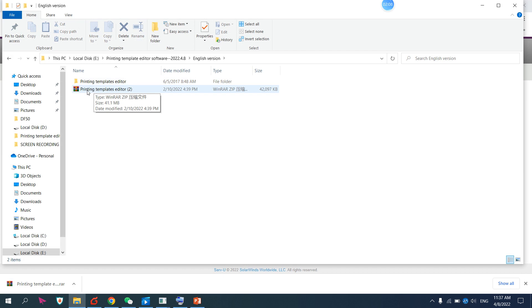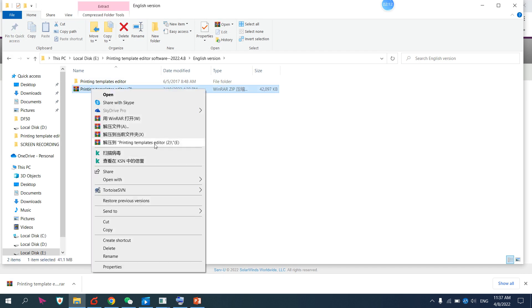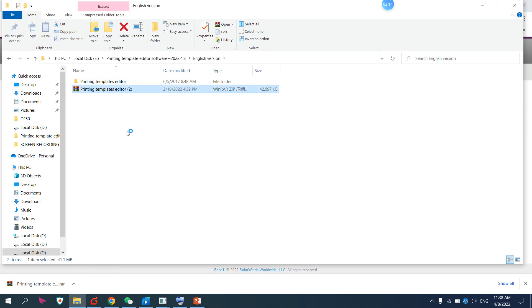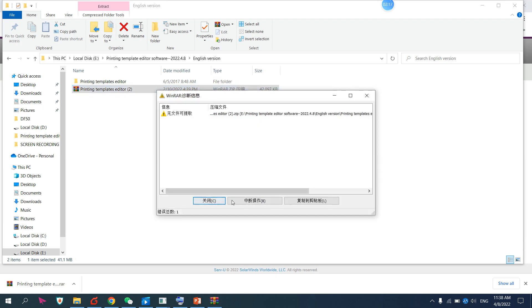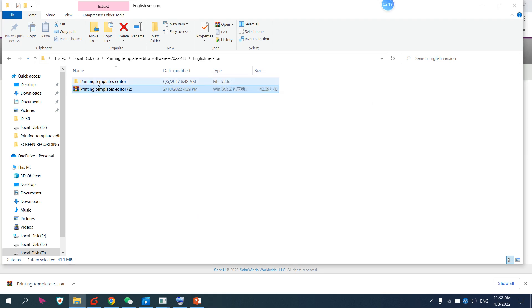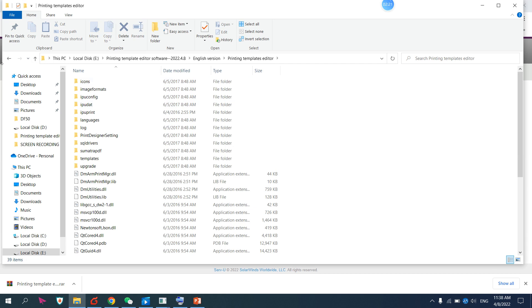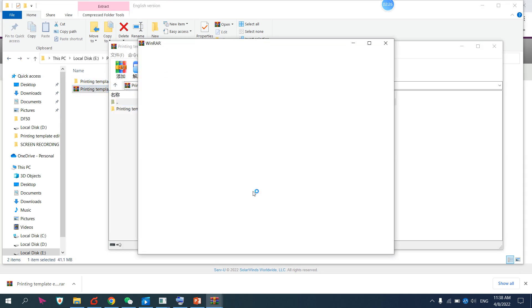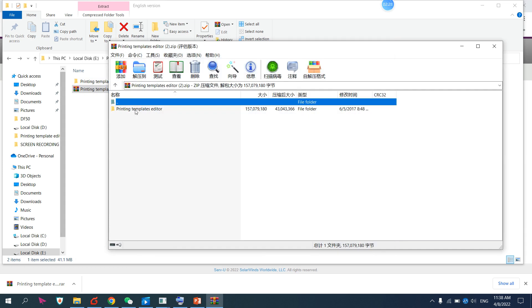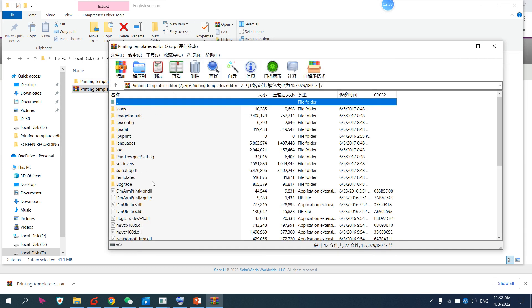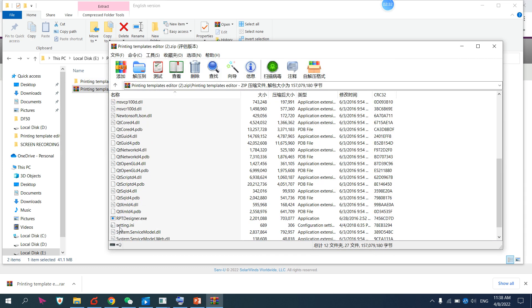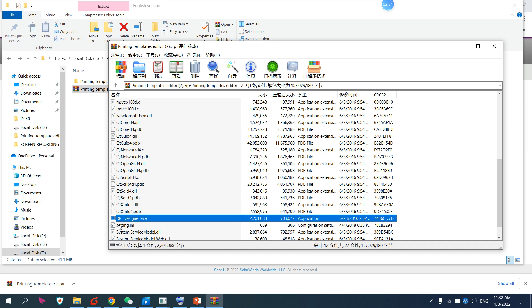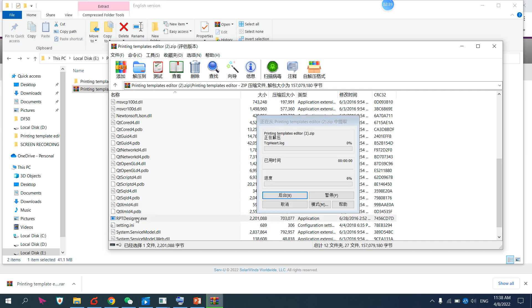You will need to unzip the file first. I already have it unzipped. If you want to unzip, you can do so. Once unzipped, open the folder — you can also open files directly. Then open this one: RPT Designer. Open RPT Designer.